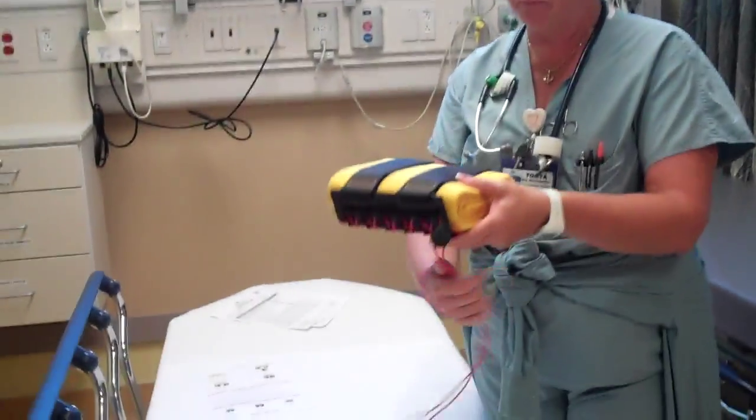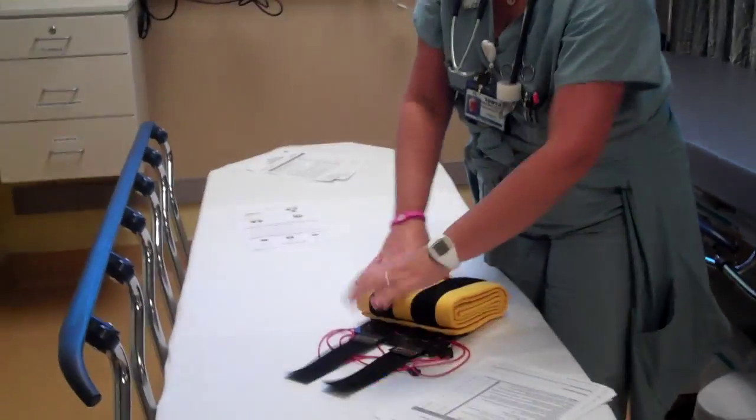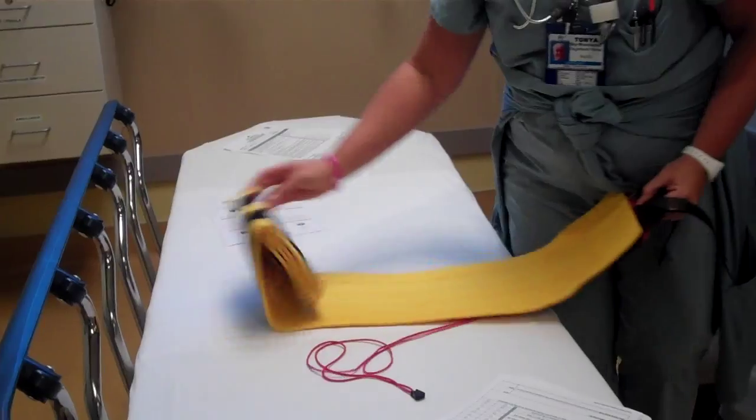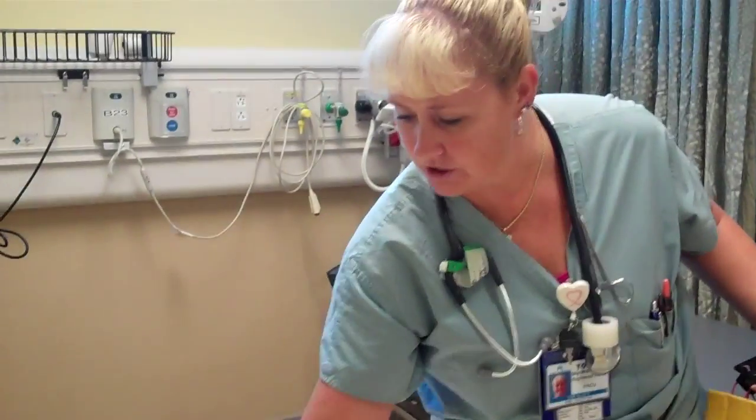It comes wrapped in a plastic wrap. It's a one-time use. So what you're going to do is open your pelvic binder just like this. The use of a pelvic binder is usually for pelvic fracture, and you want it to go at the symphysis pubis.